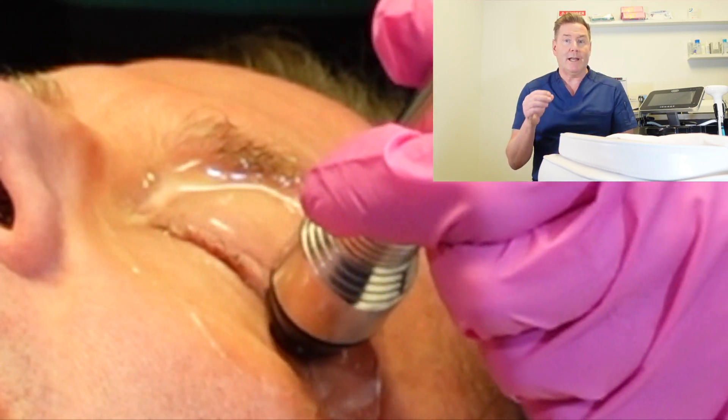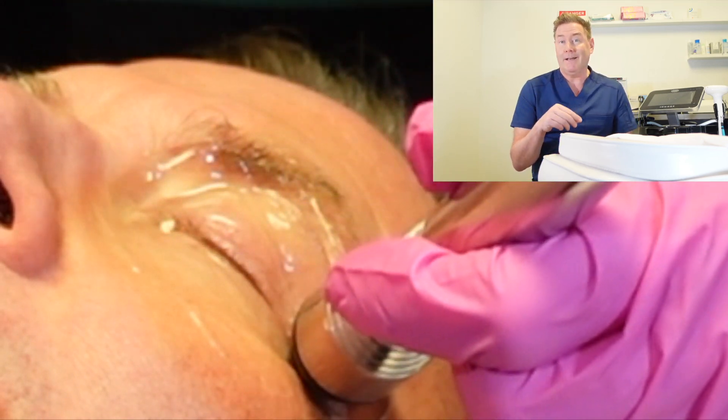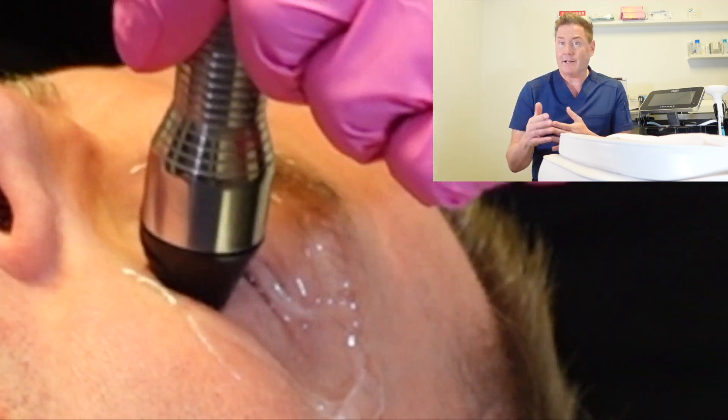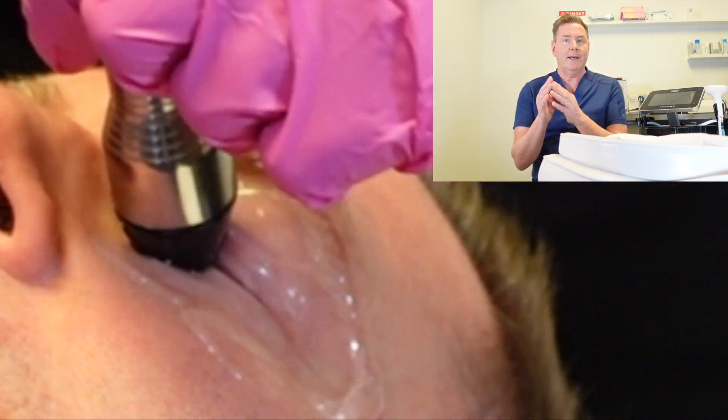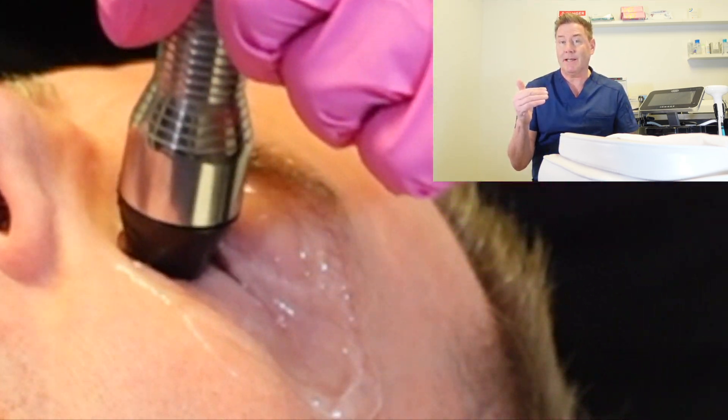The probe used has a temperature gauge on it that measures the temperature of the device about a thousand times every second. So this device is extremely precise in the temperature it sets, and it has a maximum temperature that it can be set at.